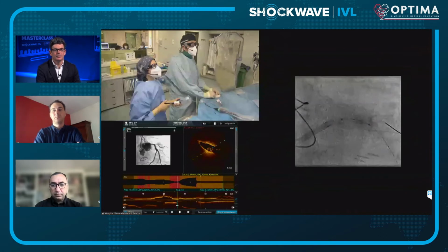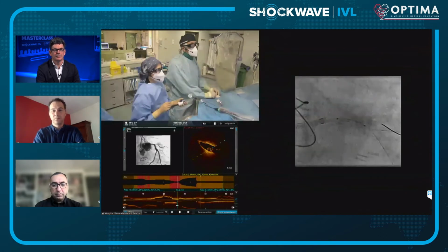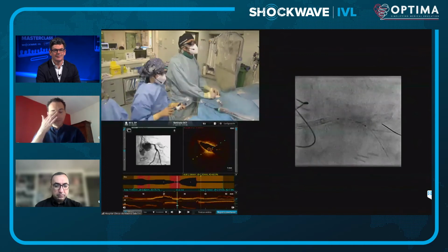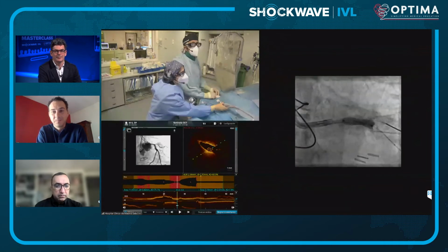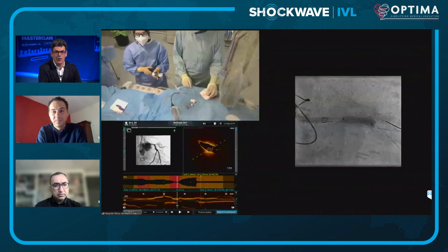I think we can probably give some more in this area. I think we can do one more here. Again, from the perspective of the patient, he is feeling well, no chest pain, no EKG changes. So I think this nicely shows there is a very heavy calcium burden in this region around this bifurcation. And as Benjamin says, there may well be fibrotic tissue as well.